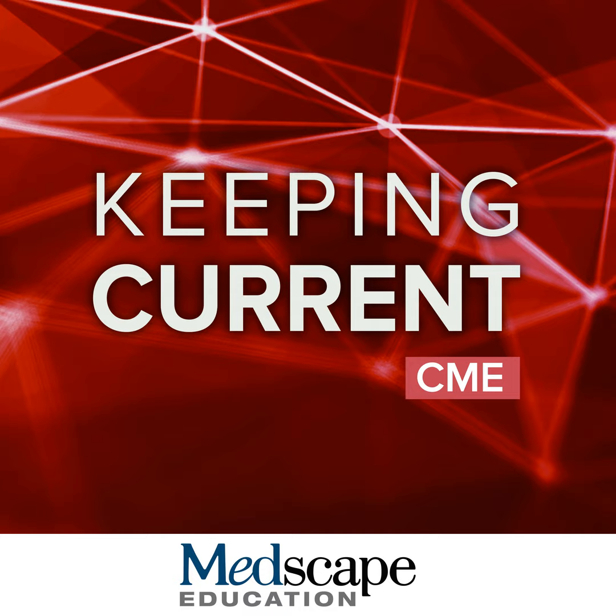That's one method. A second method that also uses contrast is called dynamic contrast enhancement imaging, or DCE. Here you inject contrast and you don't monitor the first pass, but you monitor the slow extravasation of that contrast in the interstitial space. And finally, there are also ways to assess perfusion imaging without using any contrast agent.